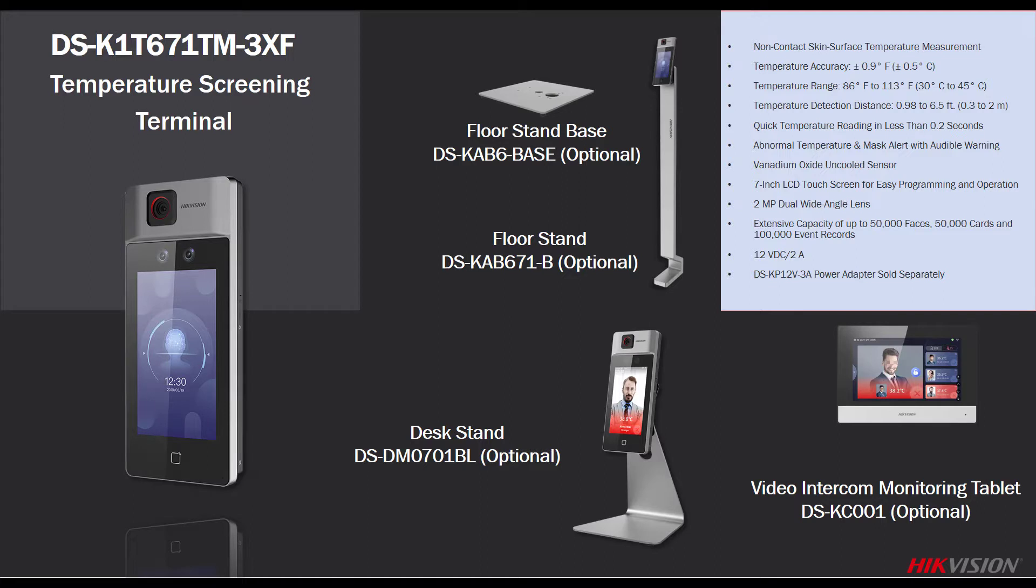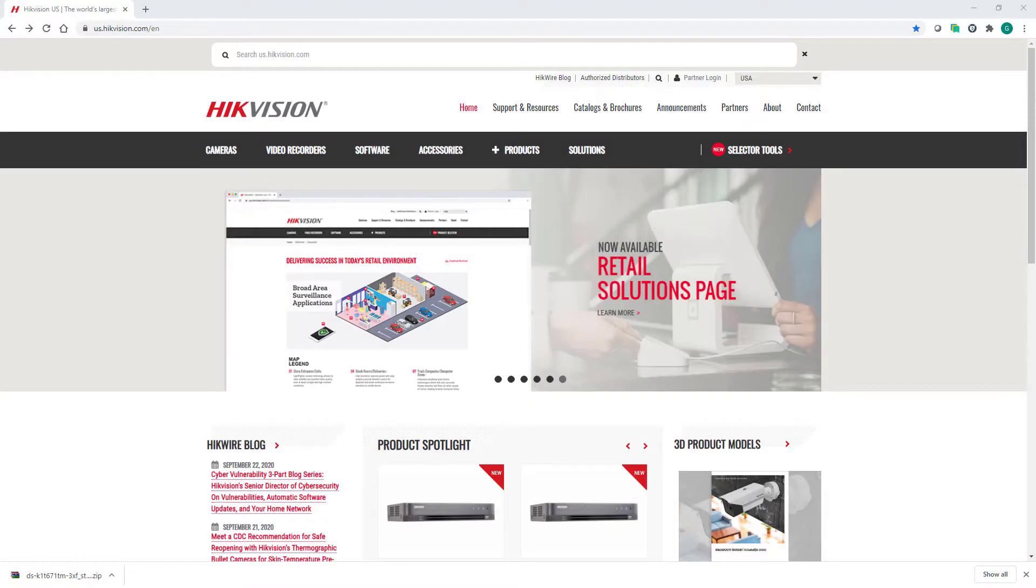You want to make sure that you've got the latest firmware, and if you're going to use any of our software clients, you want to make sure you have that as well. So how are we going to get those items?